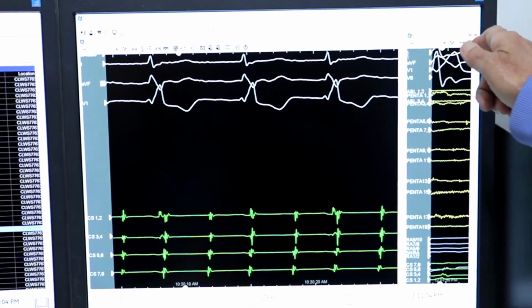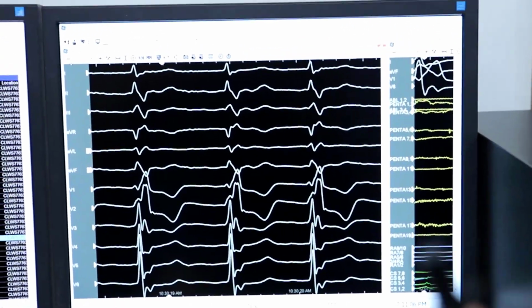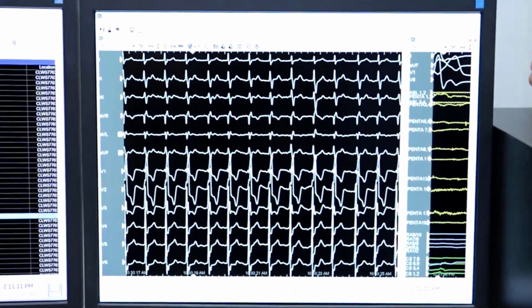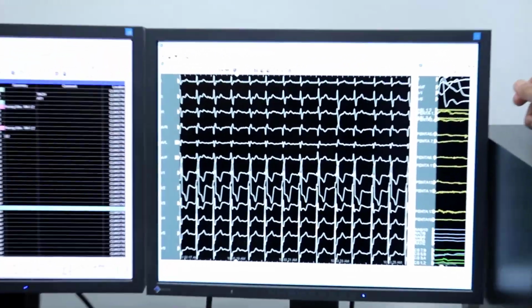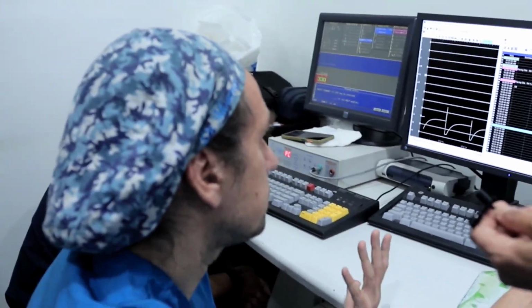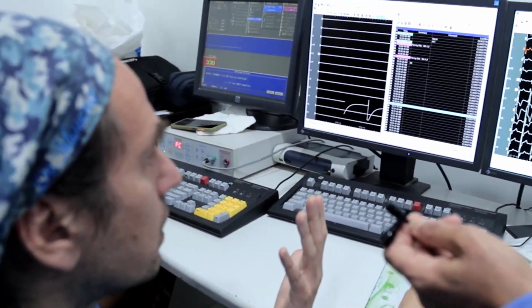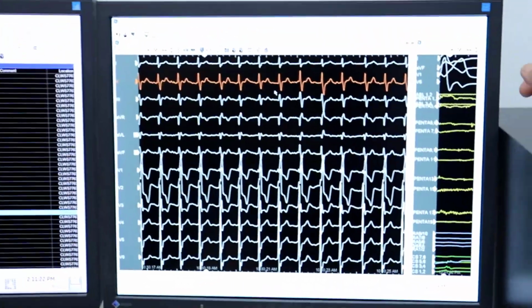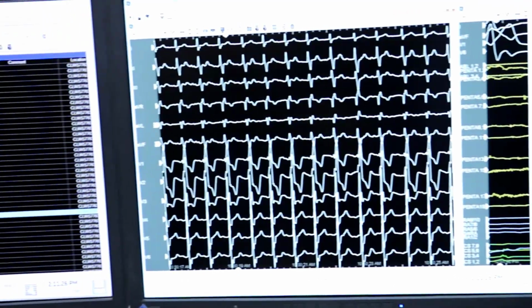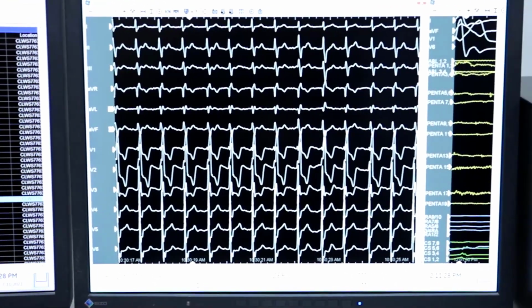Oh, cycle length, yeah. So I guess this is the one that he had, that then he was diagnosed with atrial fibrillation. Yes, because if you look at this, you cannot see any P wave here. So I guess this is the one where, as she said at the beginning, it might be an atrial tachycardia. And this should be the counterclockwise rotation.